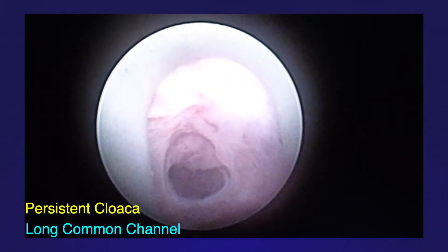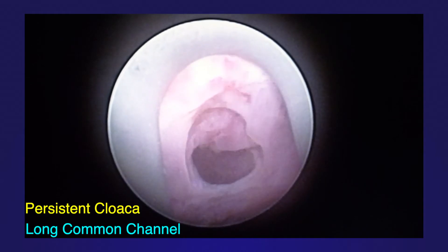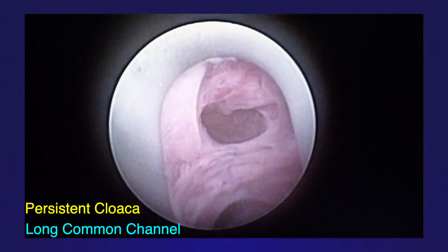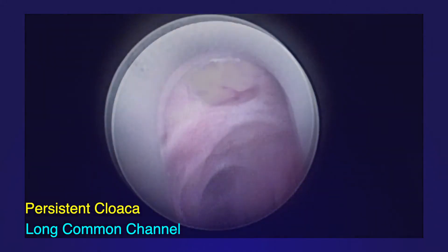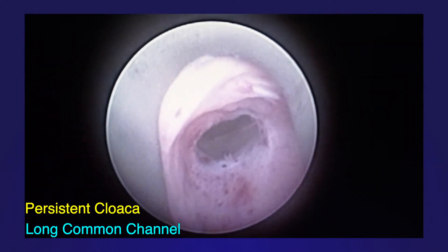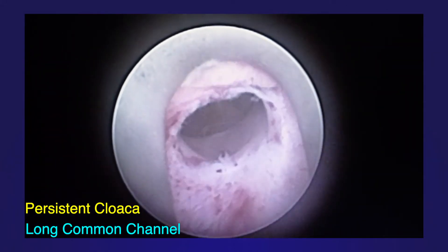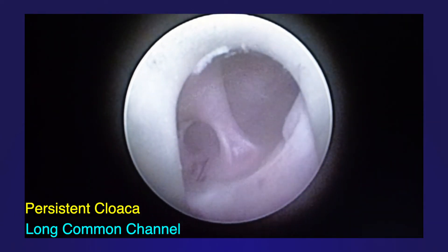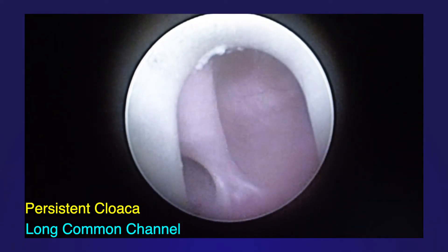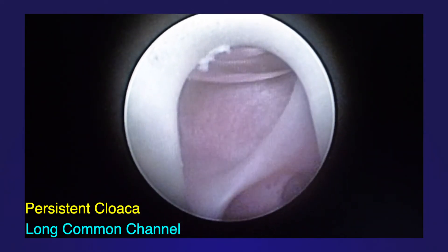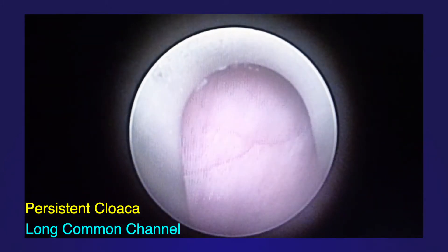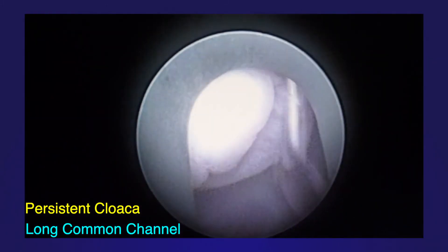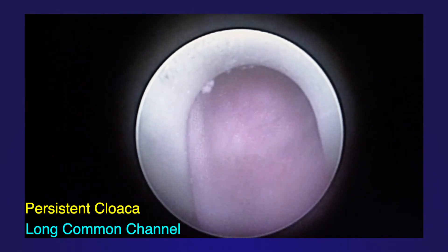This video shows an endoscopy of a long common channel. The first bifurcation is seen approximately 3 centimeters from the perineum. The common channel continues proximally and a trifurcation is seen another 3 centimeters more proximal to the first bifurcation. The trifurcation is formed by two hemivaginas anteriorly and the rectum posteriorly.